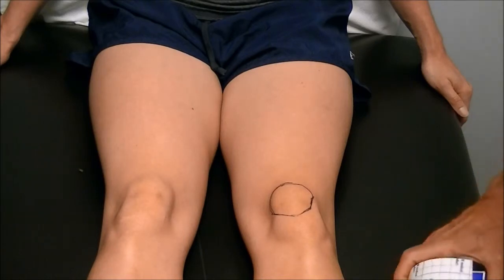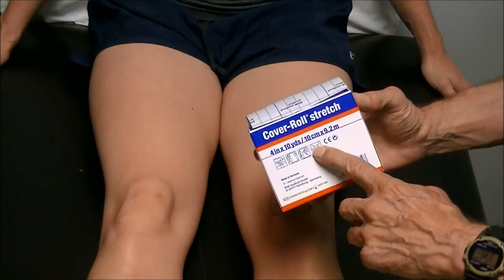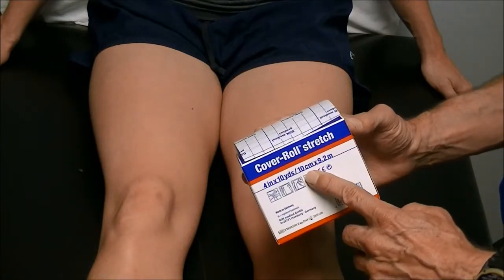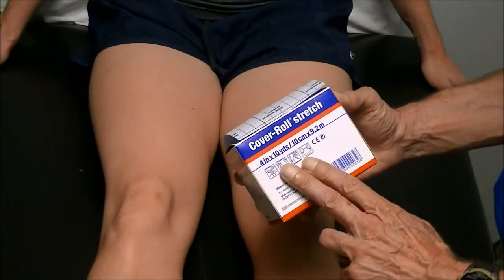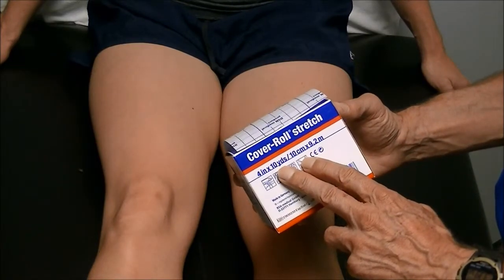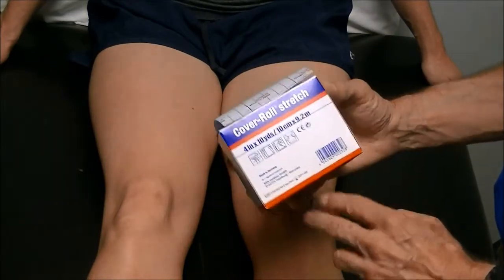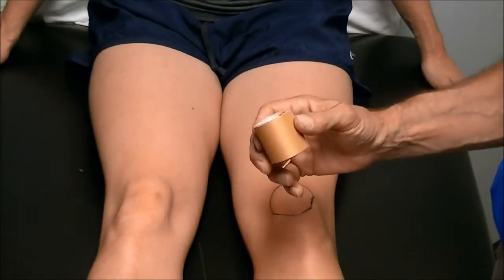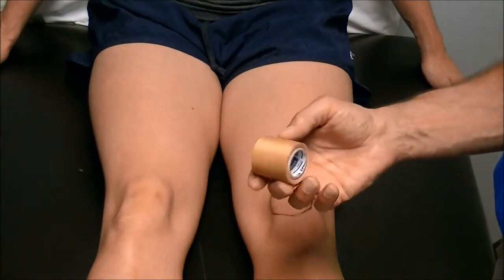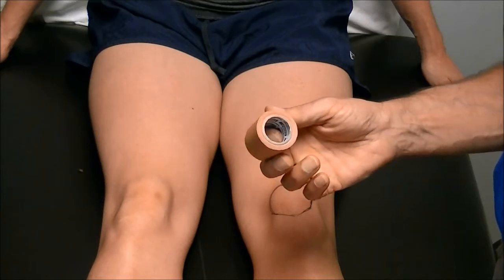For the McConnell taping technique we use two tapes. There's the cover roll — I like using the 4-inch; it's just a hassle using a 2-inch — and it's by Beiersdorf. I always like to use the original tape. I've tried to use the other brands but they're not as sticky and they don't stay on as long. I use a 4-inch by 10 yards; this is about $18 to $20 wholesale online. And this is the Leuko tape, also by Beiersdorf. There are other brands out there, I just don't have as much success with them lasting as long when I put it on.